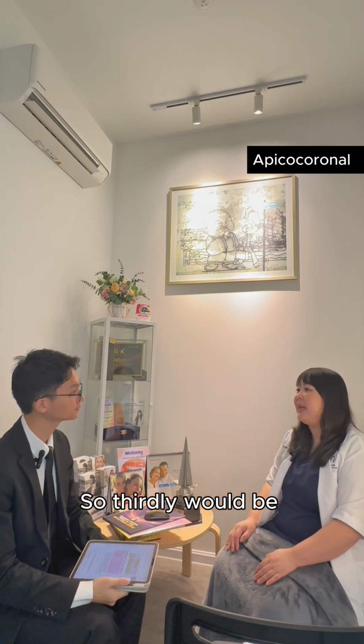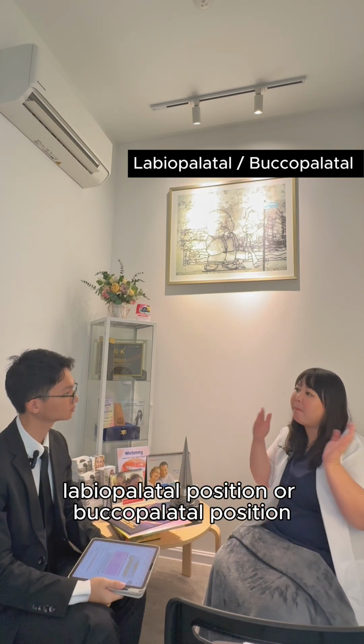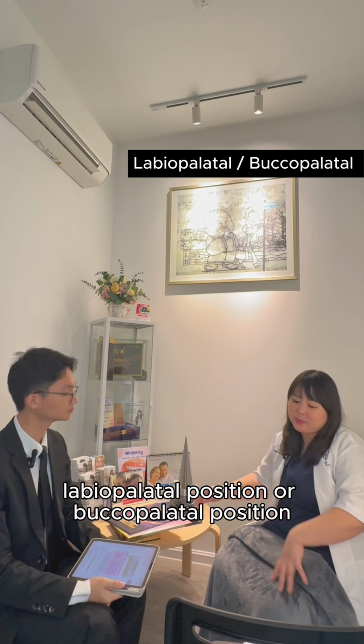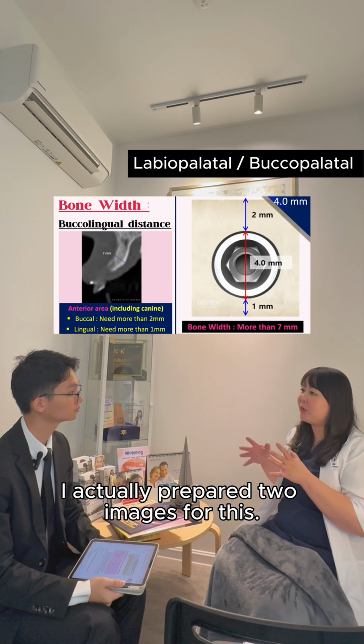So thirdly would be labial-palatal position or buccal-palatal position, also known as bone width. I actually prepared two images for this.